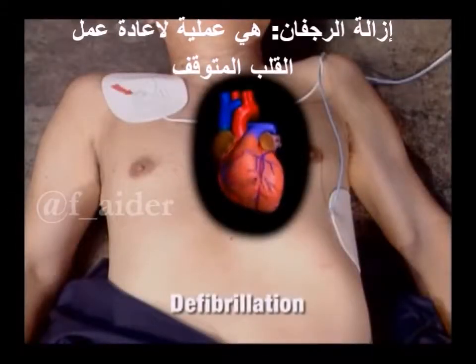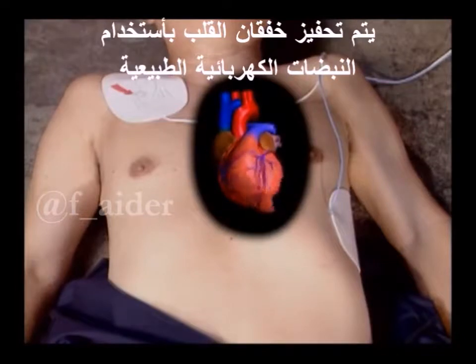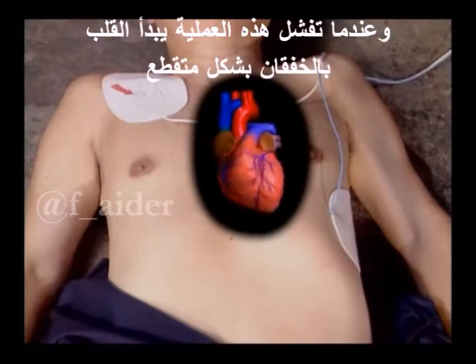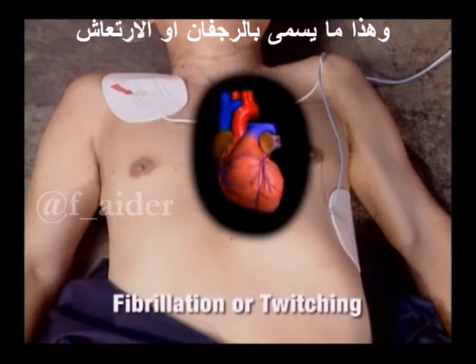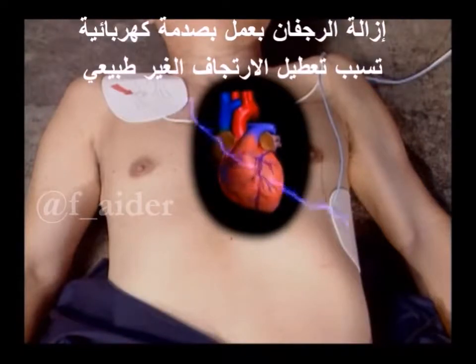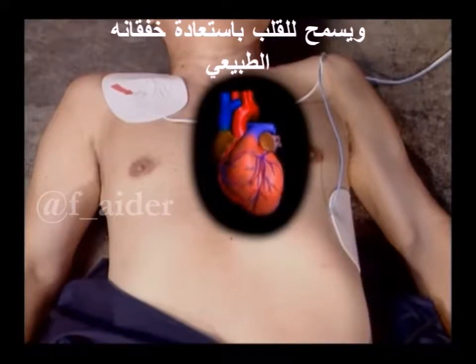Defibrillation is the process of restarting an erratic heart. Natural electrical impulses control your heartbeat. When these impulses fail, the heart beats erratically and no longer pumps blood. This is called fibrillation or twitching. Defibrillation administers a shock that momentarily disrupts the erratic signals and allows the normal heartbeat to return.